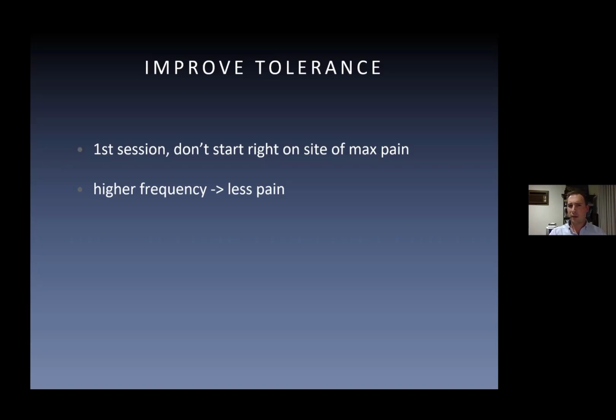I very rarely use the 36 millimeter one when I'm treating heel pain, plantar fasciitis, plantar fasciopathy. I tend to stick with our standard applicator. The reason is that with such a thick fat pad, using that broader applicator, I'm going to lose a bit of energy in the fat pad itself. Whereas with the Achilles insertion, I'm not worried about that.